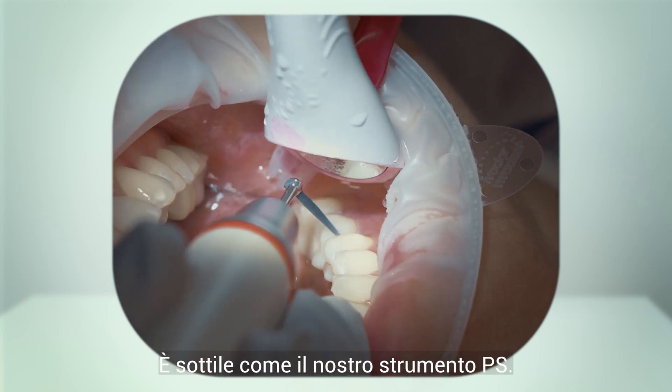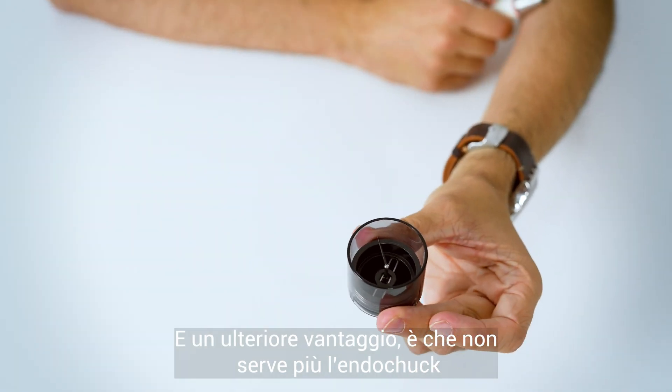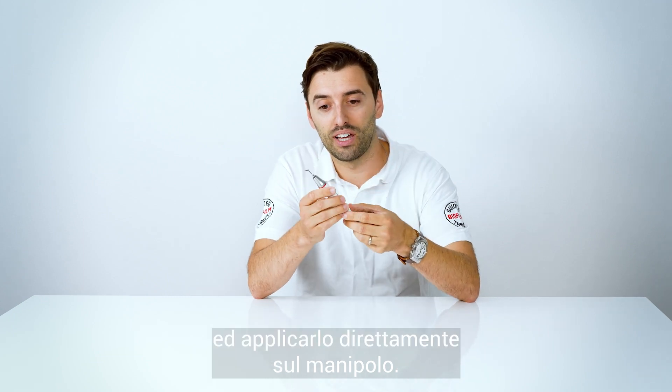It's thinner than our PS instrument, and the good thing is you don't need the EndoChuck anymore, because we can use the combi torque and apply it directly on the handpiece.